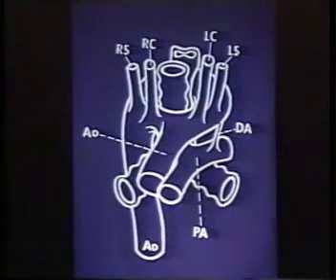Now, I believe that the interleaved images give you your best images. There is no skip, and even small gaps, which you may utilize, can result in confusion. So I've now gone to interleaved images. It may result in a slightly longer examination.